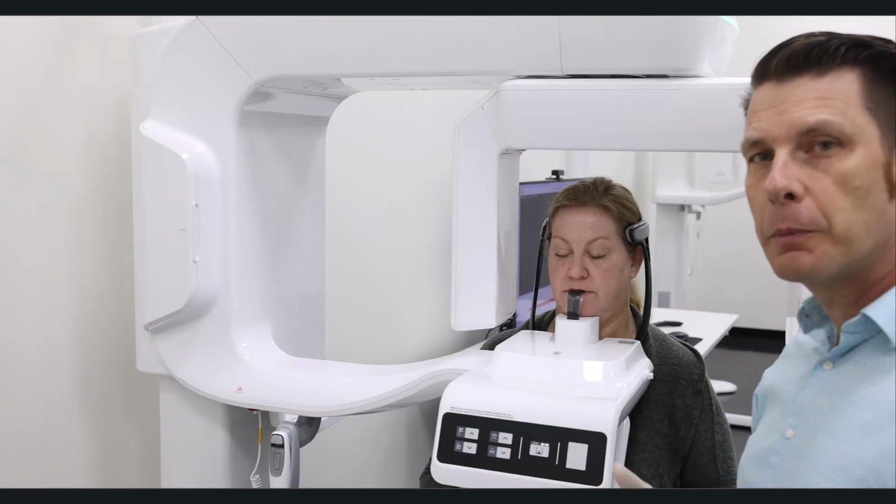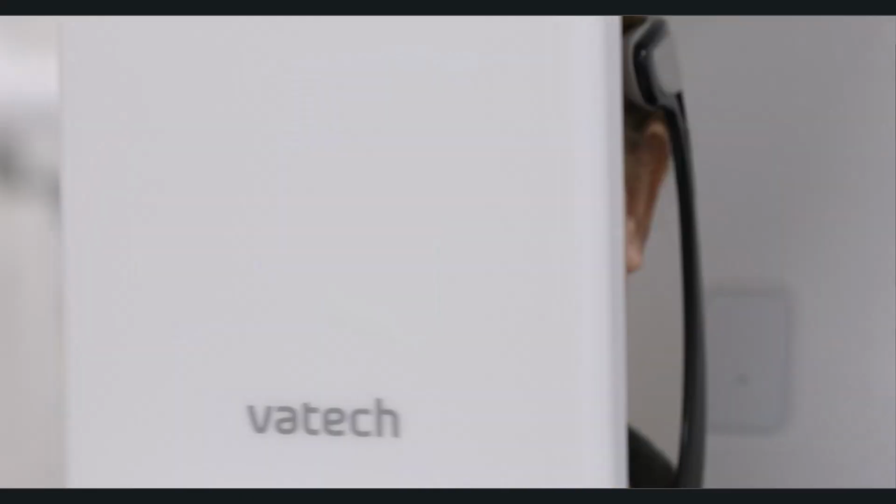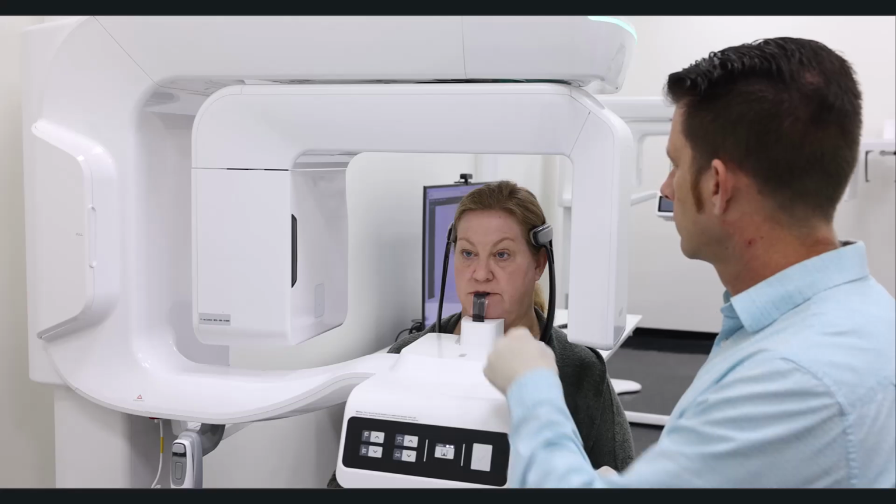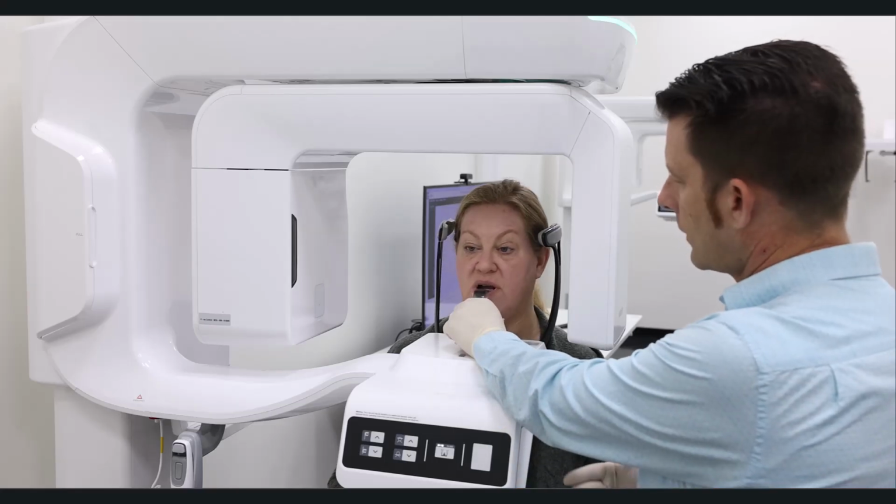Once capturing has been complete, we can come back in and let our patient out of the machine once the temple supports open. Please open your eyes and follow the operator's instructions. Go ahead and open and go ahead and take a step back.